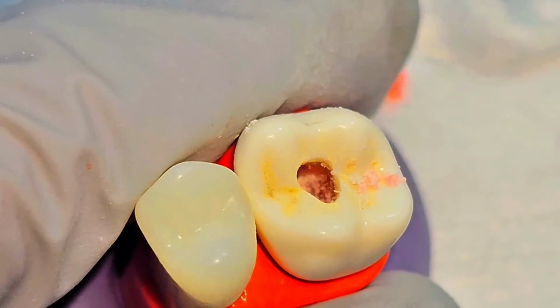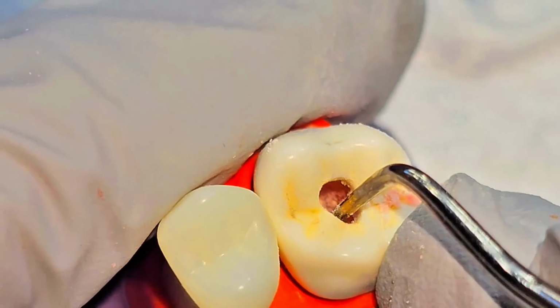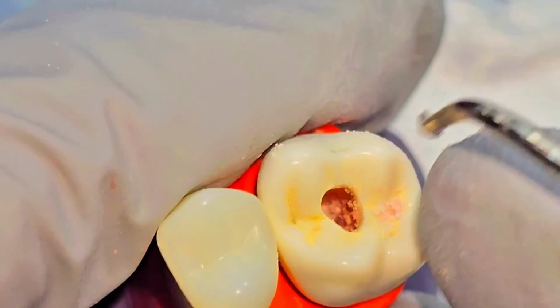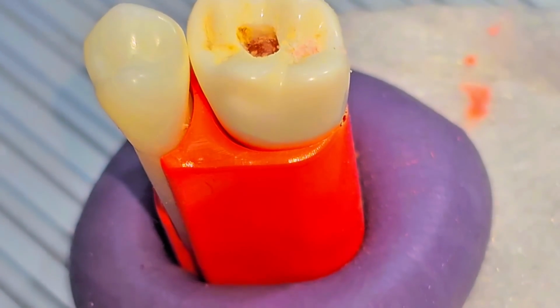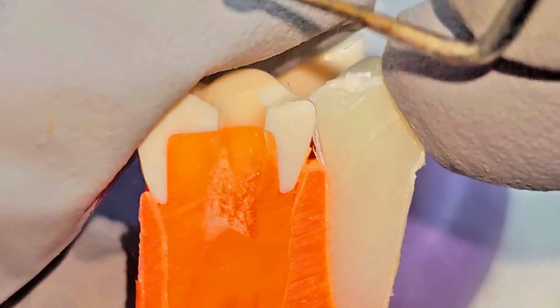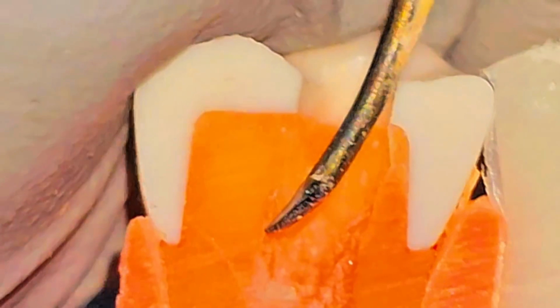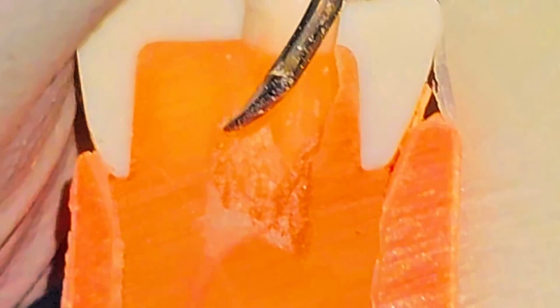So pretty much it is straight. Now I don't catch any, but like here a little bit. The pulp horn that I mentioned is this. If you see the access prep, this is straight, but slightly there is some ledge or some catch.